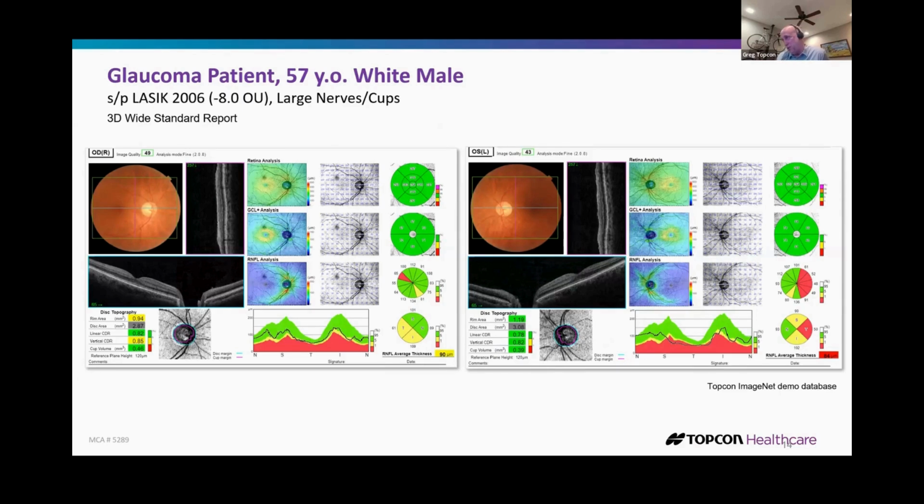Yeah. Well, visuals are important. I mean, again, you show this pie chart here to somebody, they might think they're looking at their Fidelity Wealth Management aggregate or something. I mean, it doesn't really, red is bad. That's fine. I'll see you in a year or whatever. But that Hood report, it hits you. I wasn't thrilled the first time I saw it. But anyway, very interesting. And again, that's gleaned from a 3D wide scan, that big fat wide scan we like to do on everybody. Next slide, please.